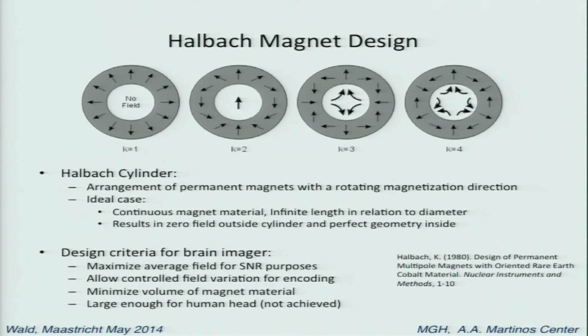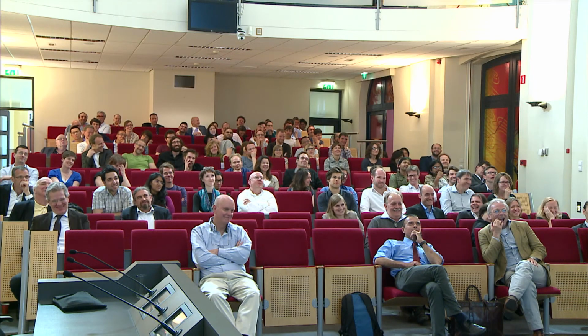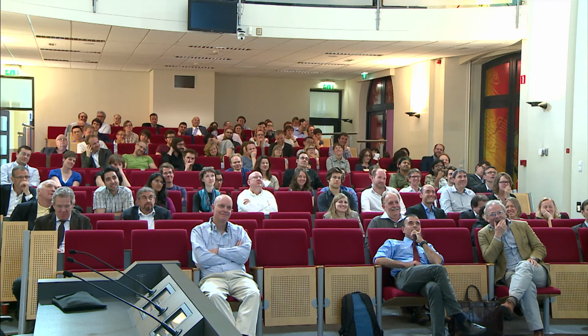For those of you not familiar with the Halbach design, it works just like birdcage coils. If you're not familiar with birdcage coils, sorry. But we use the same mode, where we get a nice transverse uniform field just by rotating the phase of these magnets 0 to 2 pi around the loop. You can buy these magnets at gaussboys.com on the internet. They're sold basically for hobby purposes, but they will take your fingers off. Believe me, you want to be a little careful.